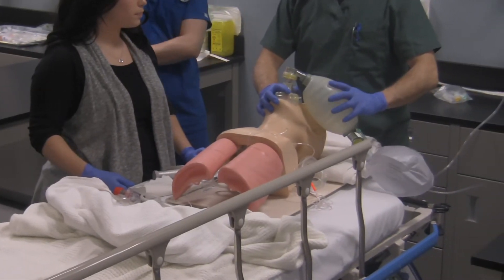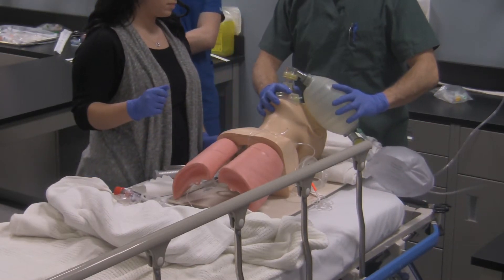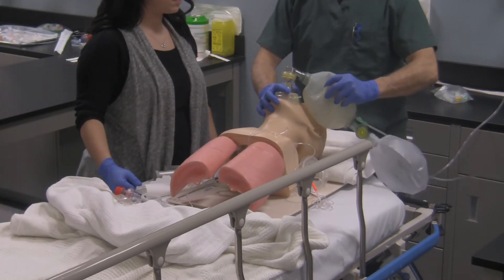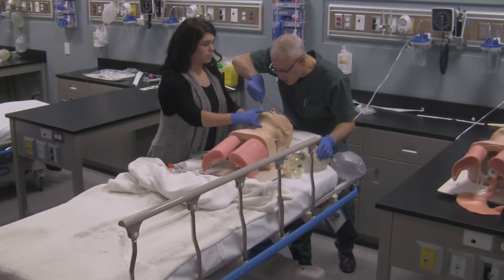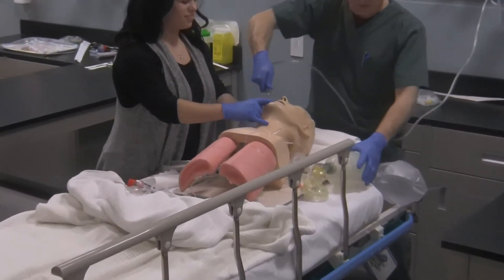Brittany, when I take the mask off, can you pull the OPA out? Donald, you're going to feel that piece of plastic come out of your mouth, and I'm going to put another piece of plastic in to clean out the back of your airway. Everything's up, going as far as I can see.